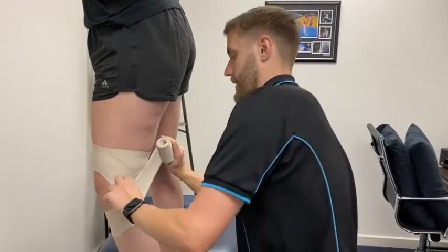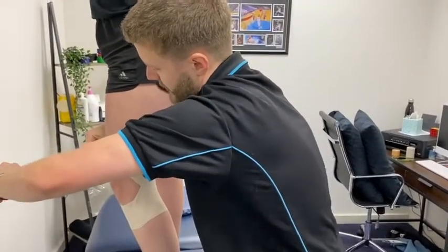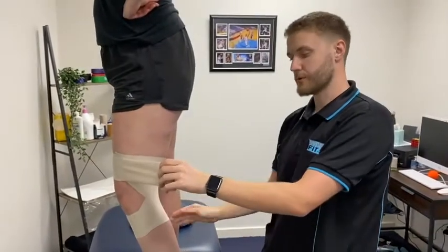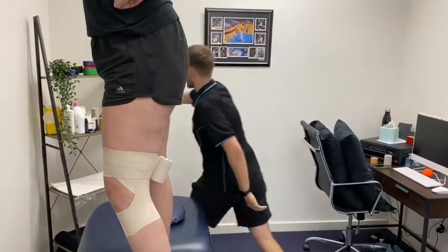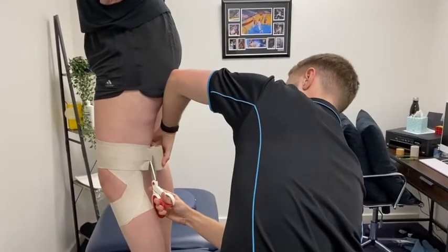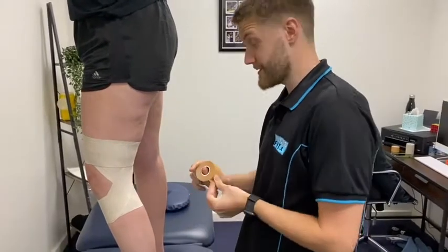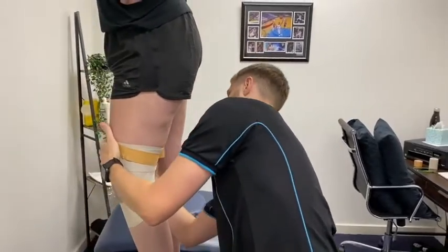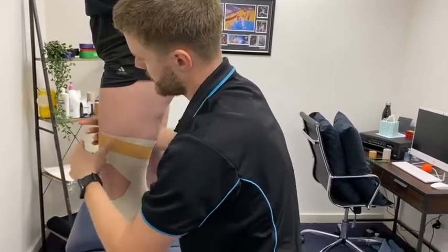We're going to do a wrap down and a wrap up like so. Depending on how comfortable your athlete or patient is with their knee, you can do multiple criss-crosses or just the one. We'll just do the one now for the sake of this video. Then we'll cut that tape off — I find you get the best stickiness if you do another rigid wrap over the top just to lock that one off.